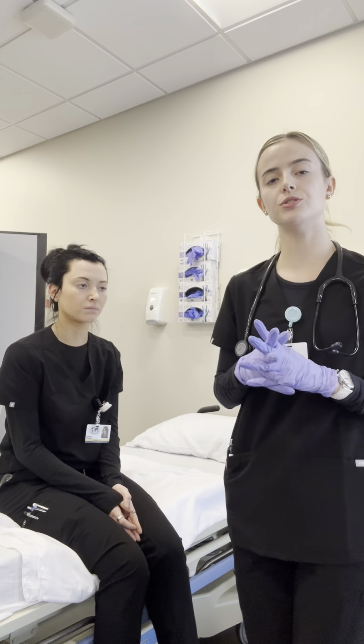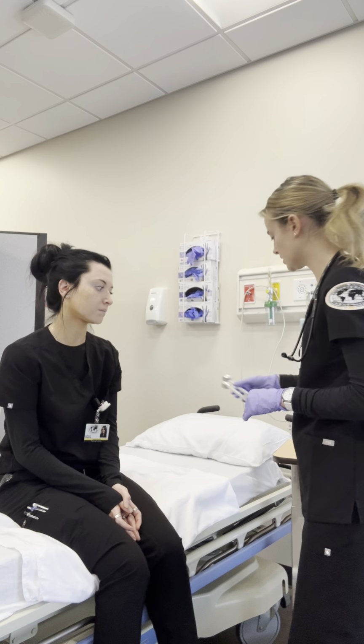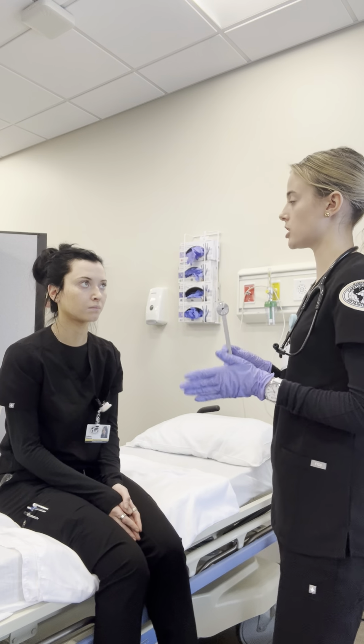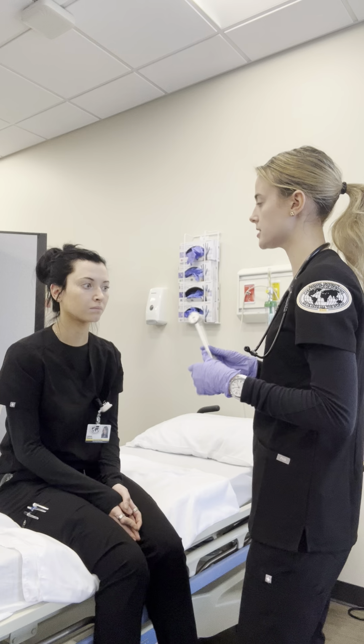And now I'm going to do a Weber test. So I am taking my tuning fork, and this is also testing for cranial nerve 8. So I'm going to strike this and place it on top of your head. Nothing crazy, just some vibrations.